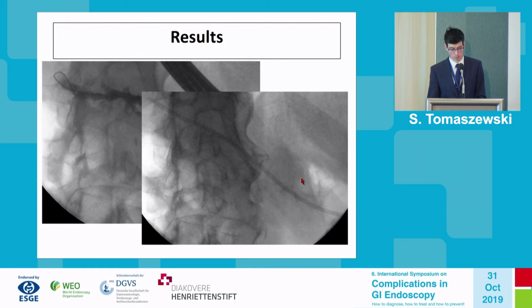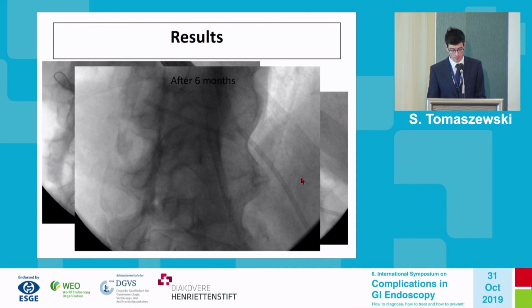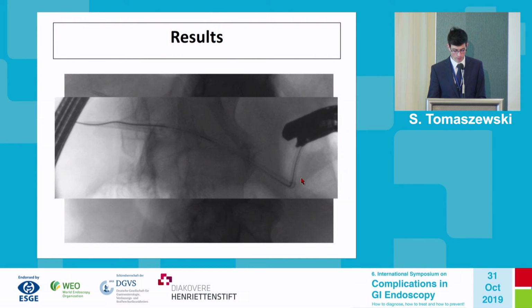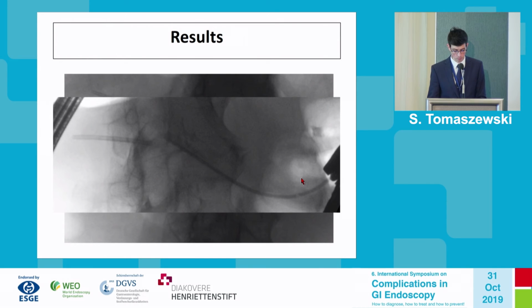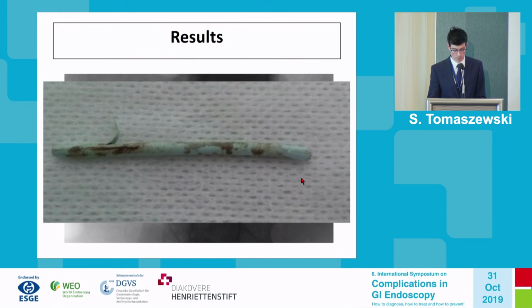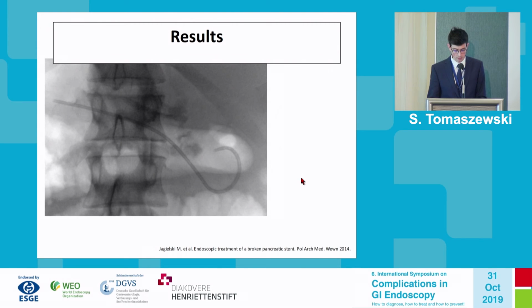The polypectomy snare was the only device that could allow us to do it. That is the same patient, and this is the fragment of the prosthesis.